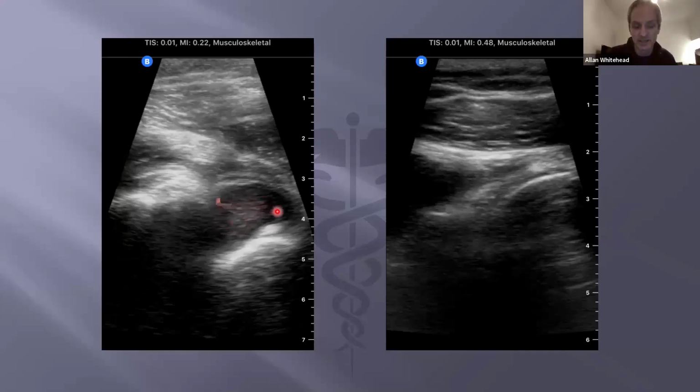This joint space, again, shows you that when you do the injection, which we'll talk about later, to numb it, there's a means to reduce the shoulder painlessly. You've got a nice big target to aim for. You might not see this clot or hemarthrosis so clearly, but it just goes to show you don't have to be that precise with your needle tip like you do for some nerve blocks. Post reduction, the glenoid, that flat C or S, probably S shape better here, flat S shape. And then the curved humeral head articulating very nicely with the glenoid.